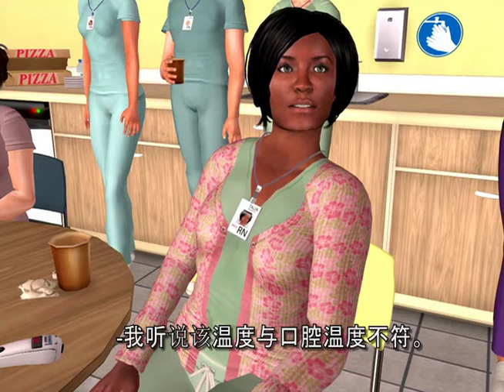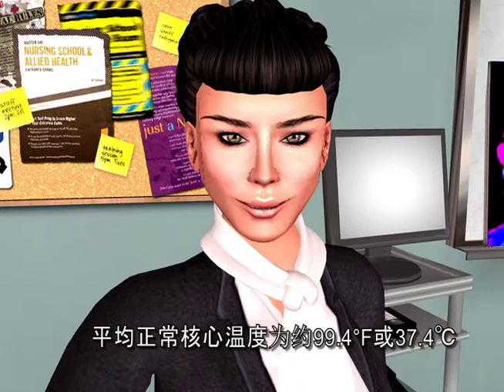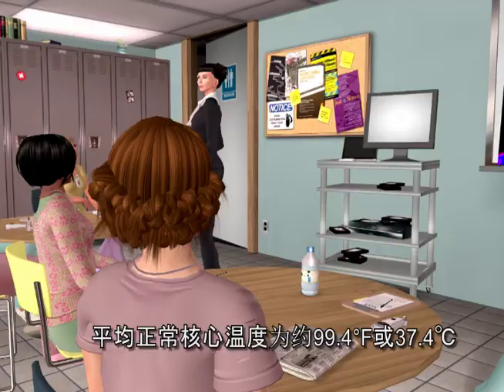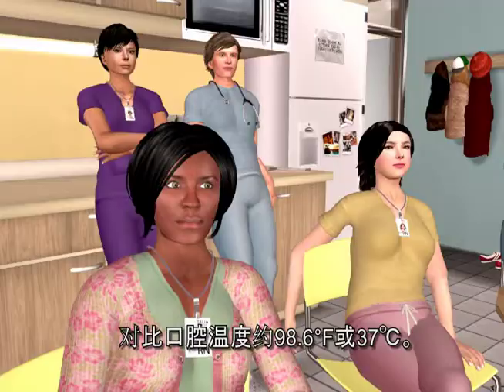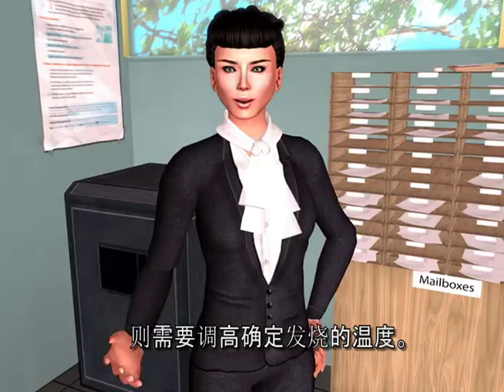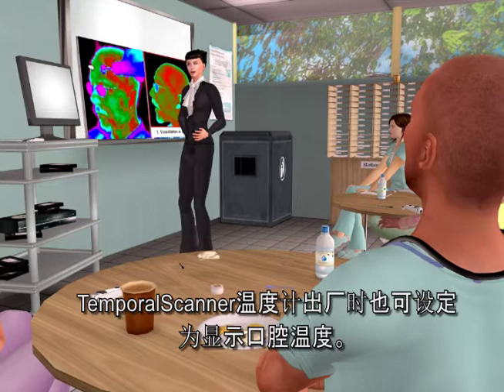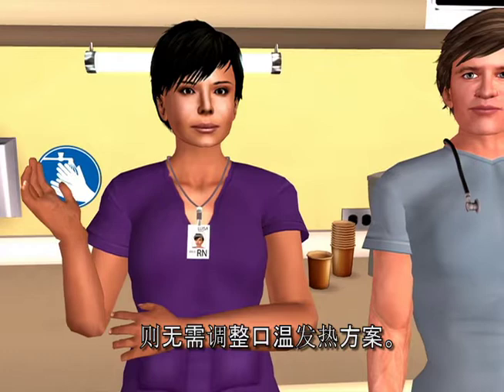The temporal scanner is measuring core temperature, about one degree Fahrenheit or half a degree Celsius higher than an oral temperature. The mean normal core temperature is about 99.4°F or 37.4°C, versus about 98.6°F or 37°C for an oral temperature. Your fever protocol will need to be adjusted upwards if your current protocol is based on an oral temperature. The temporal scanner is also available in an oral equivalent calibration, in which case no adjustment is required.